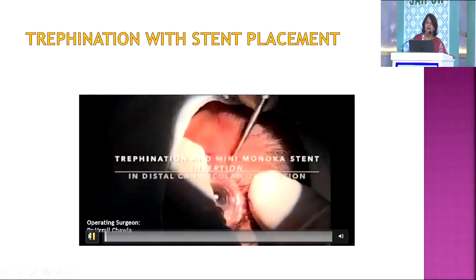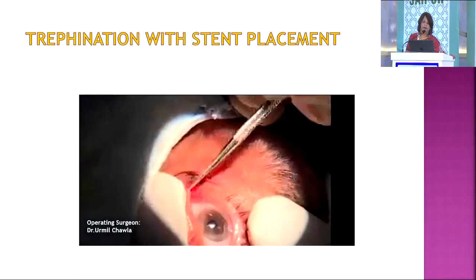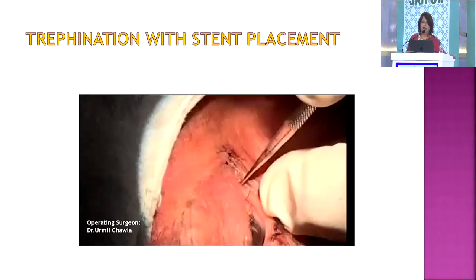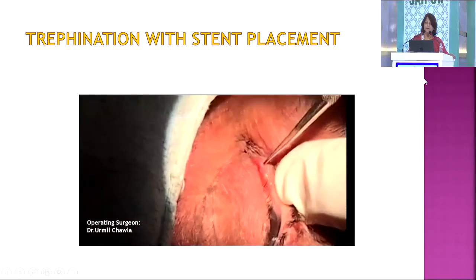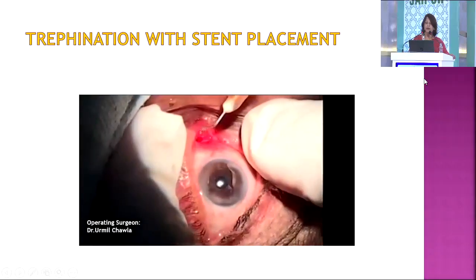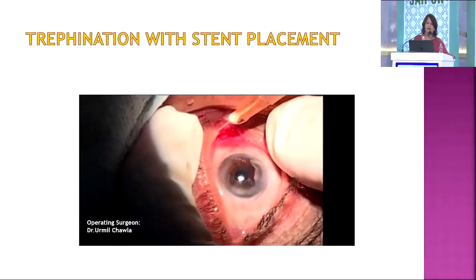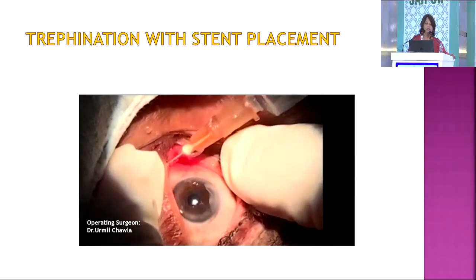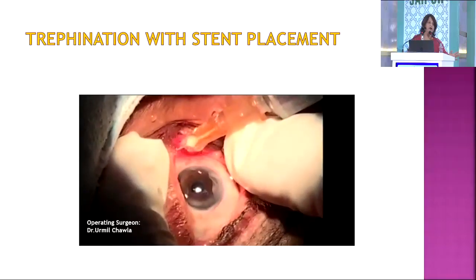Please check the video. After doing a punctum dilatation, you can just do a syringing on the table, and for a canalicular block, the fluid will be coming out from the same punctum. As we all know, in NLDOs, it comes out from the opposite punctum.